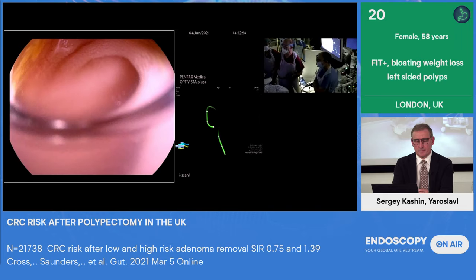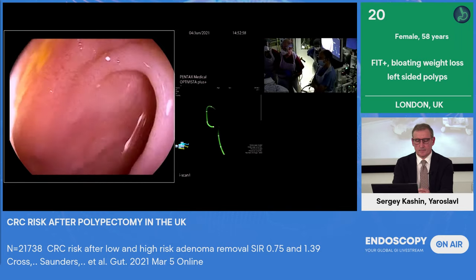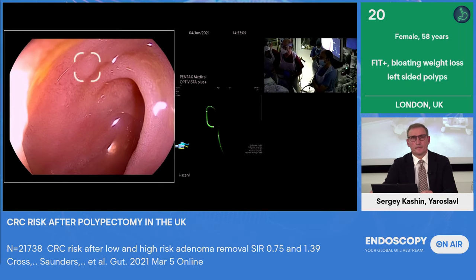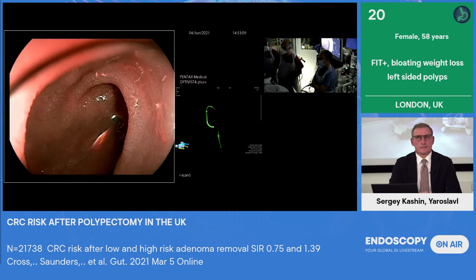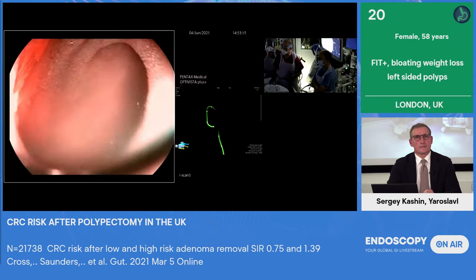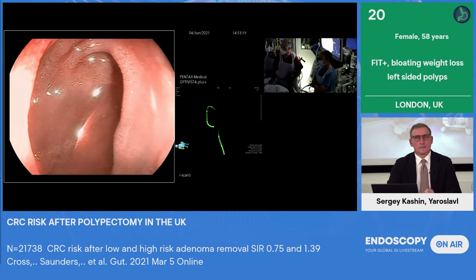So just getting back to the endoscopy, we've popped into the terminal ileum, and I'm just flicking through the different imaging modalities on the Pentax OptiVista system. Here, this is iScan 1, which gives you sort of an increased color enhancement. You can see the villi quite nicely there. And then I go over to iScan 3, which is a blue light imaging post-processor technique. And again, you can see the villi quite nicely.